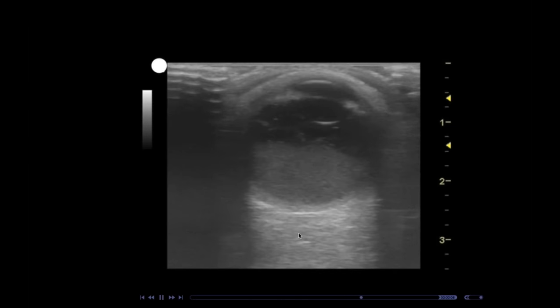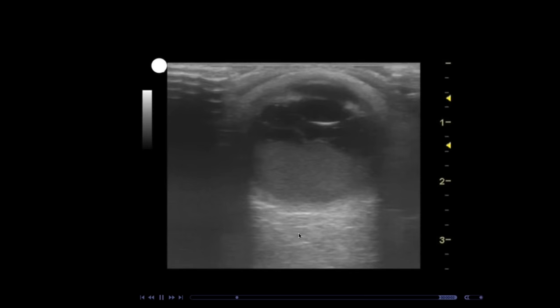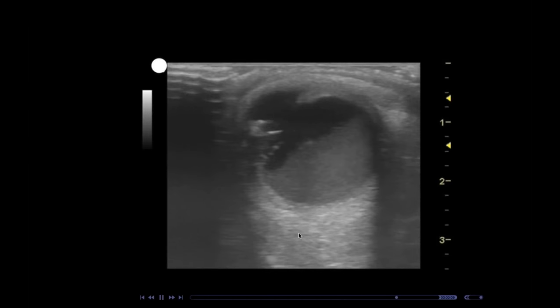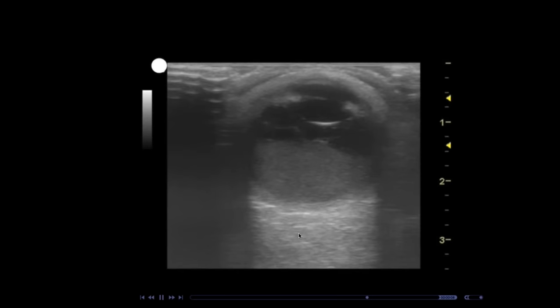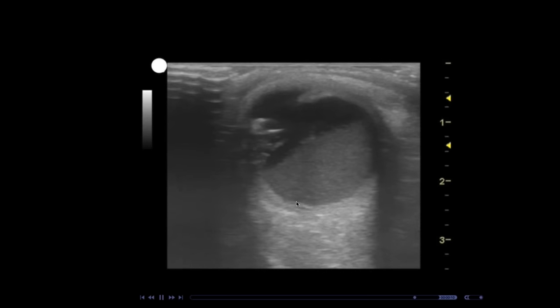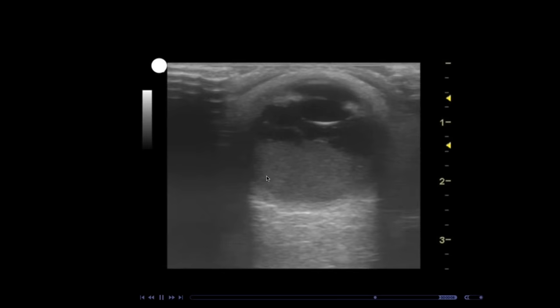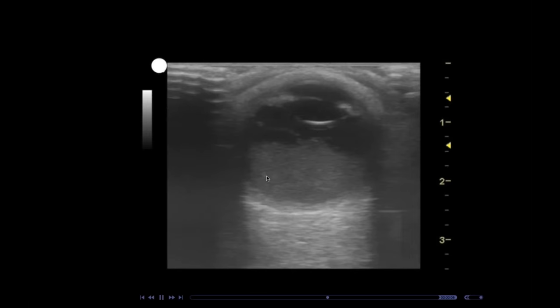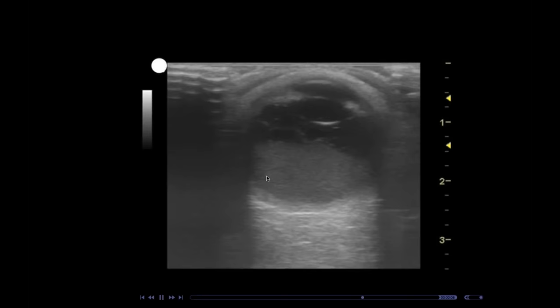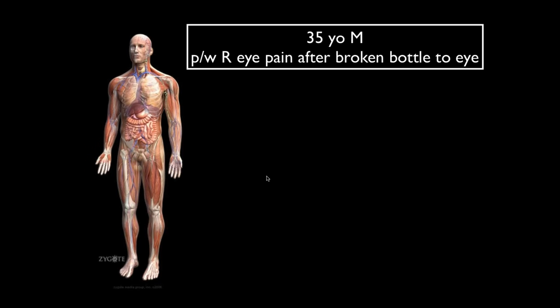Vitreous hemorrhage should be thought of as a spectrum: vitreous hemorrhage can lead to posterior vitreous detachment, then retinal tear, then retinal detachment. As blood fills the vitreous chamber, the vitreous can shrink and detach, causing posterior vitreous detachment, which can in turn cause a retinal tear. About a third to nearly half of retinal tears go on to develop retinal detachments. In this case, ophthalmology was called, the supratherapeutic INR was reversed, FFP was given, and she was observed — she did fine.